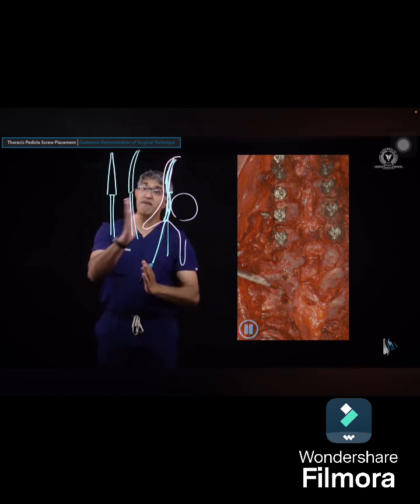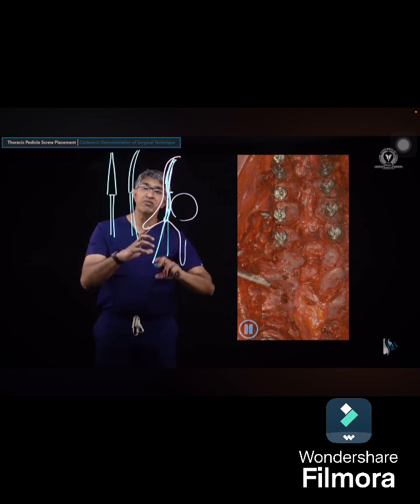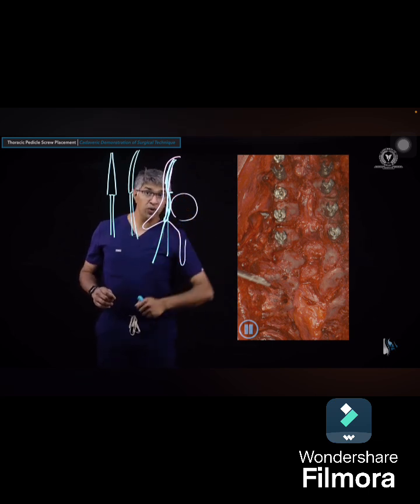The first 20 millimeters or so, you have the bevel, which is to say the convex surface, not the point, pointed medially. Then you remove it, turn it around, feed it back in softly to a depth of 20 again, and then get the rest of the distance. The rest of the distance is done without much medialization as a general rule. That's what I use when I'm doing a very small pedicle.